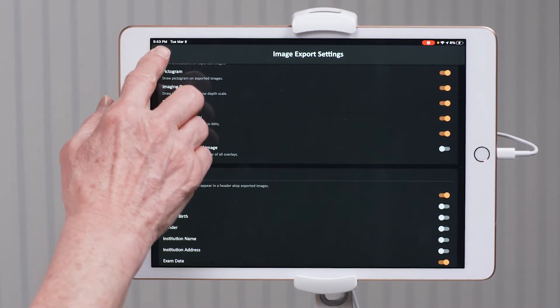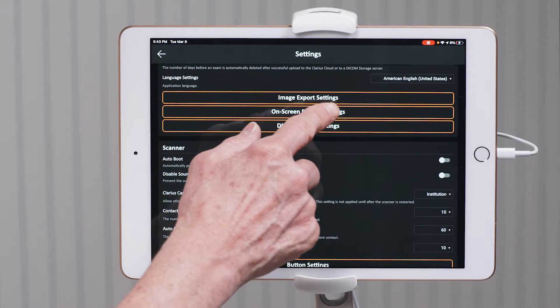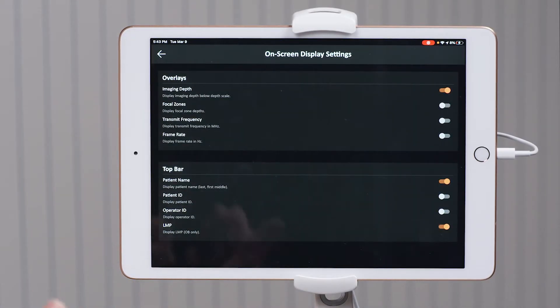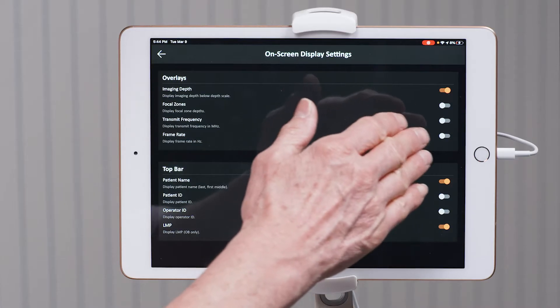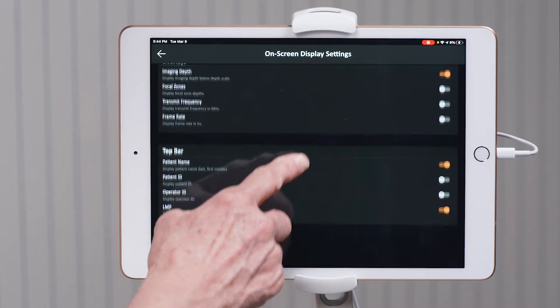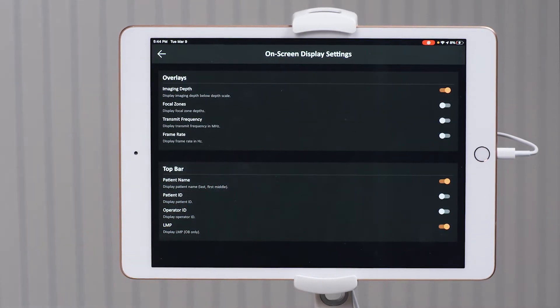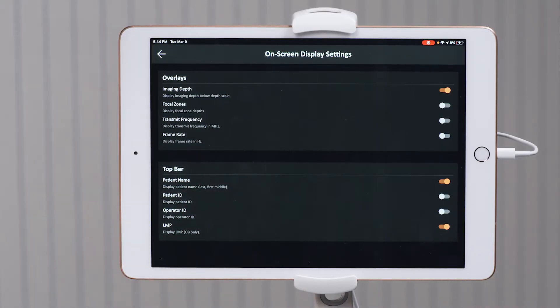Now we're going to arrow back and take a look at the on-screen display settings. As you're scanning the patient, what do you want to see as an overlay? Already turned on is the imaging depth, and I recommend that stay on — it's very useful to know the depth, for instance, for the length of a needle you'll need for a procedure. The next three are turned off and I recommend those stay off. As we come down to the top bar, all of yours are turned off in your app. I have included the patient name as well as the last menstrual period for my OB patients.